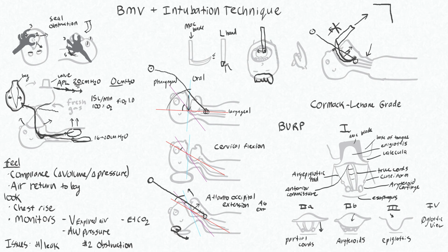So you're going to push it down below the epiglottis, and then you will improve your view. So that's the back pressure. Up, just a little bit like this, and then that can advance the glottis more towards you. Basically, it doesn't move it much, but it can help. And then right.